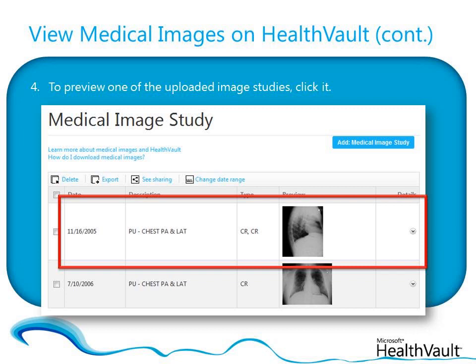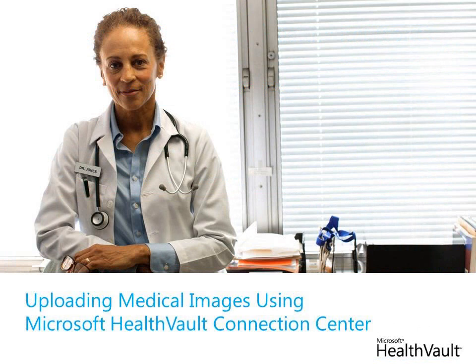In this video, we've looked at how to use the latest version of Microsoft HealthVault Connection Center to upload your medical images to your HealthVault account. I hope you found it helpful.